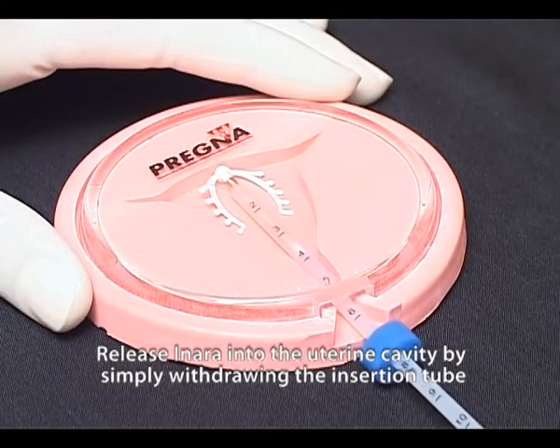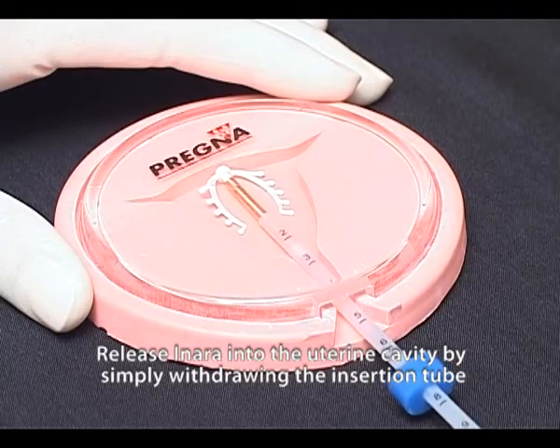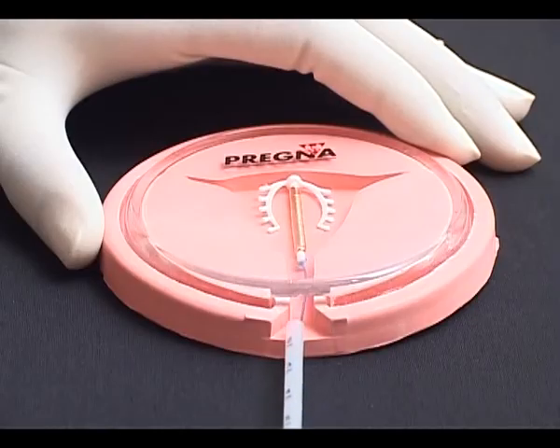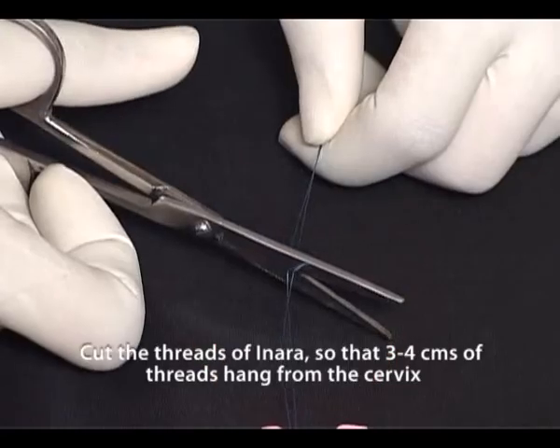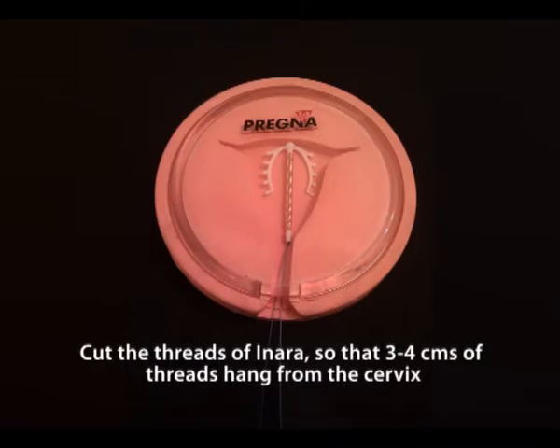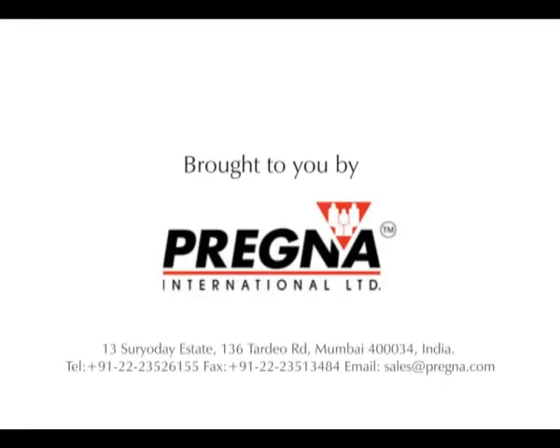Release the inara into the uterine cavity by simply withdrawing the insertion tube. Cut the threads of inara so that 3-4 cm of threads hang from the cervix.